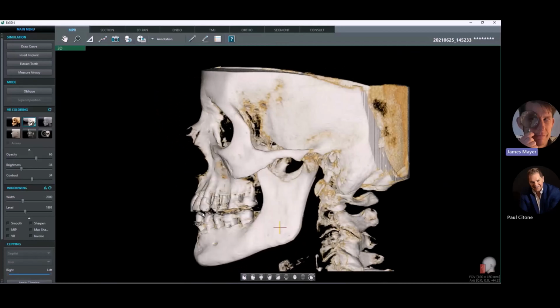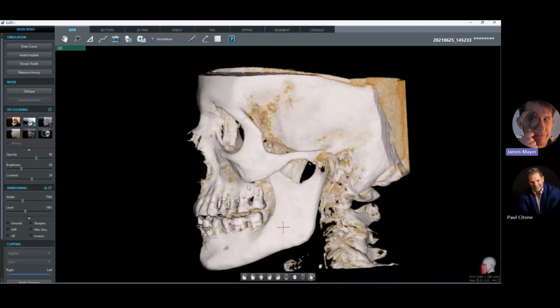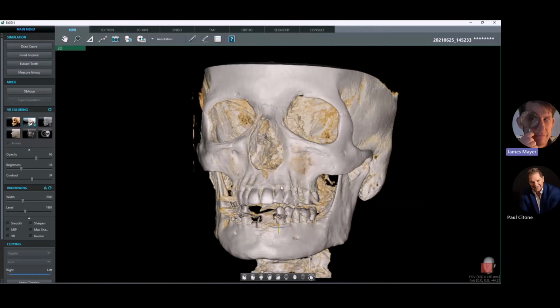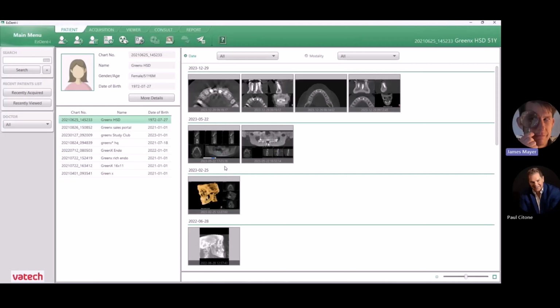That's why it's very important, like we talked about when doing our patient positioning, to ensure that the patient is positioned with their occlusion flat or parallel with the floor, because the scatter only streaks horizontally. I think that about sums up what we wanted to talk about. We touched on looking at scatter, we talked about evaluating patient movement, and we also talked about redoing the beam alignment on the device if we see any distortion in the images. That concludes what we wanted to review on CBCT image evaluation.